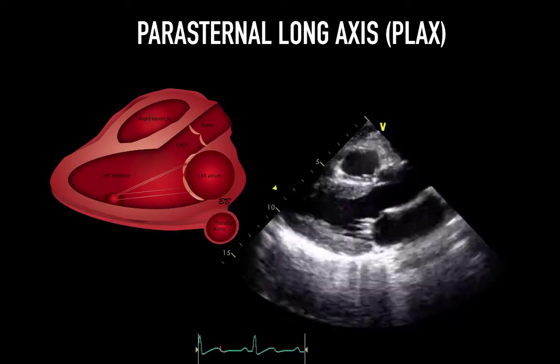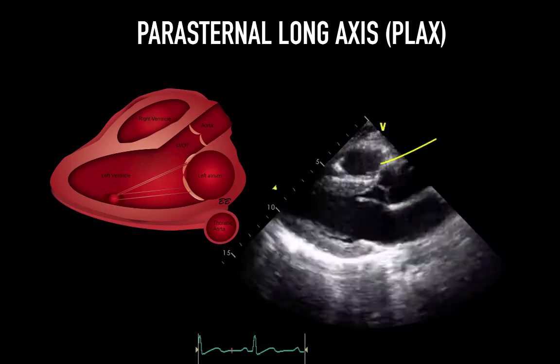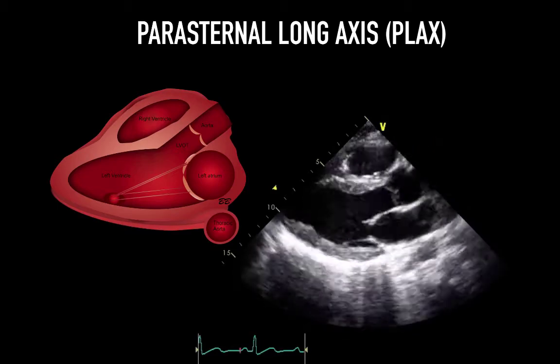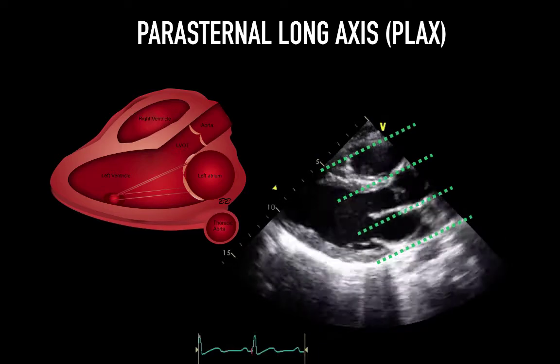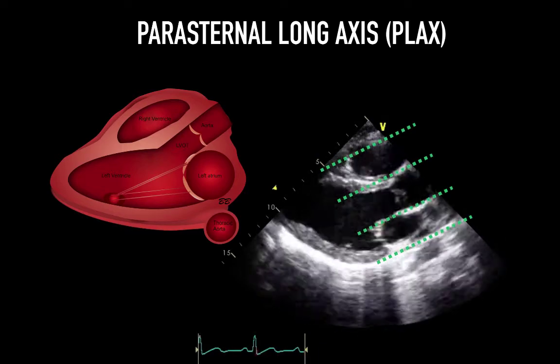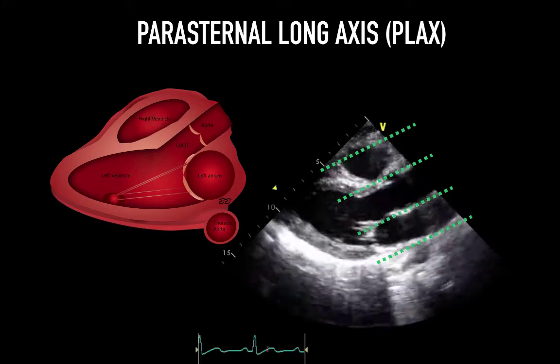The parasternal long axis view is one of the first places you may see a suggestion of a dilated RV. The anterior segment here, however, is actually the RV outflow tract. Generally, the rule of thirds is helpful in eyeballing this. Interestingly, this is oftentimes a very sensitive part in tamponade. However, I would encourage you to focus more on an apical 4 or subcostal 4 chamber.